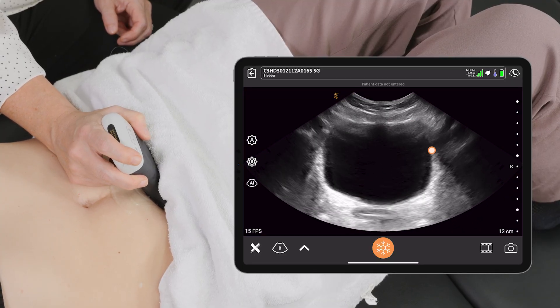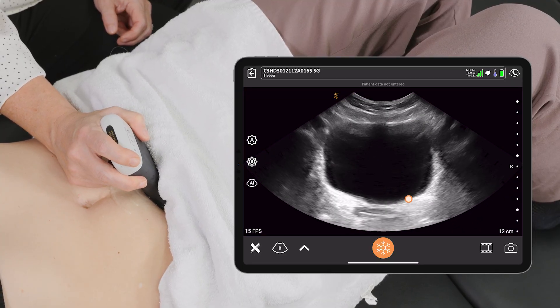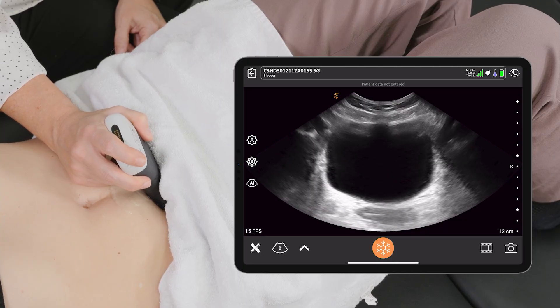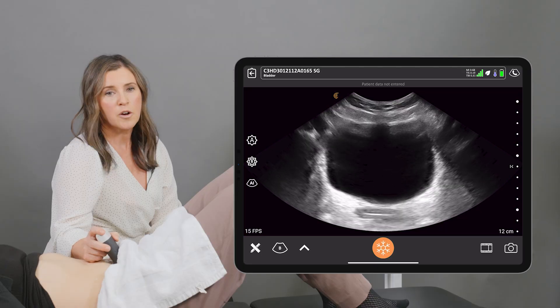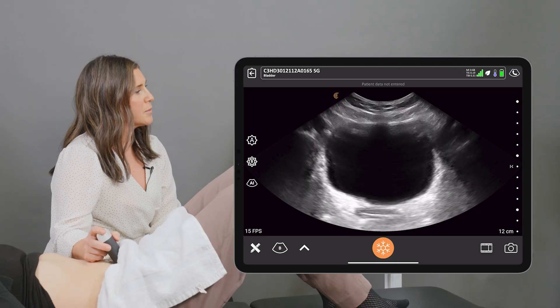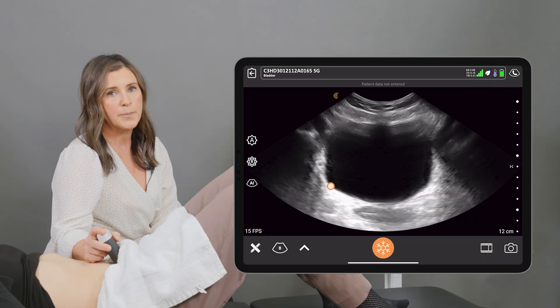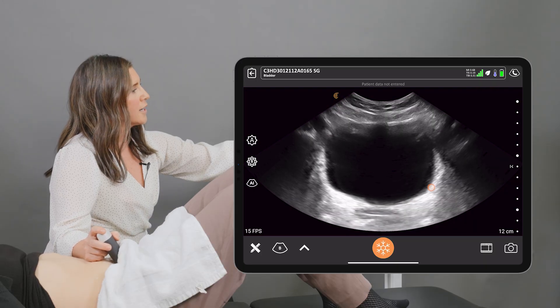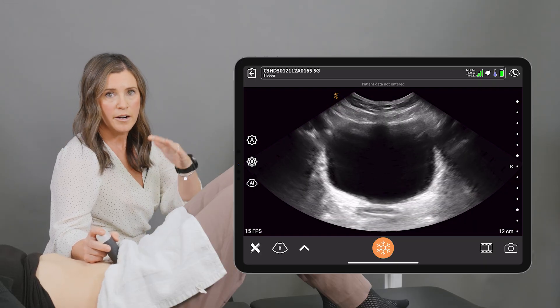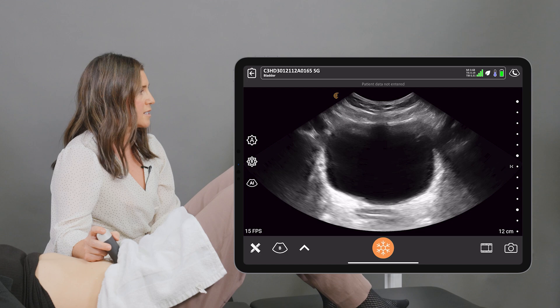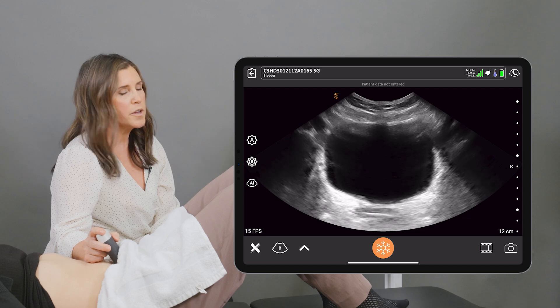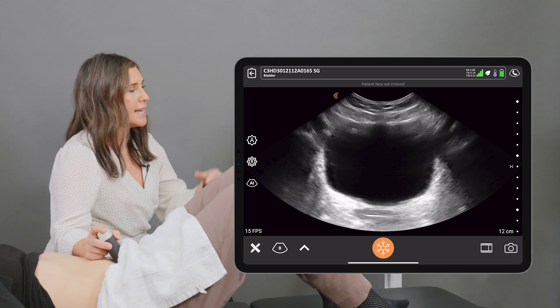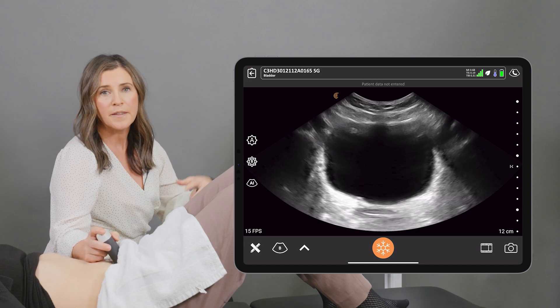The image should be nice and crisp with all four sides of the bladder visible. We're just starting out by making an observation about the symmetry of the bladder base — whether the left and right sides are looking symmetrical, or whether there's some asymmetry and one side is looking higher than the other.